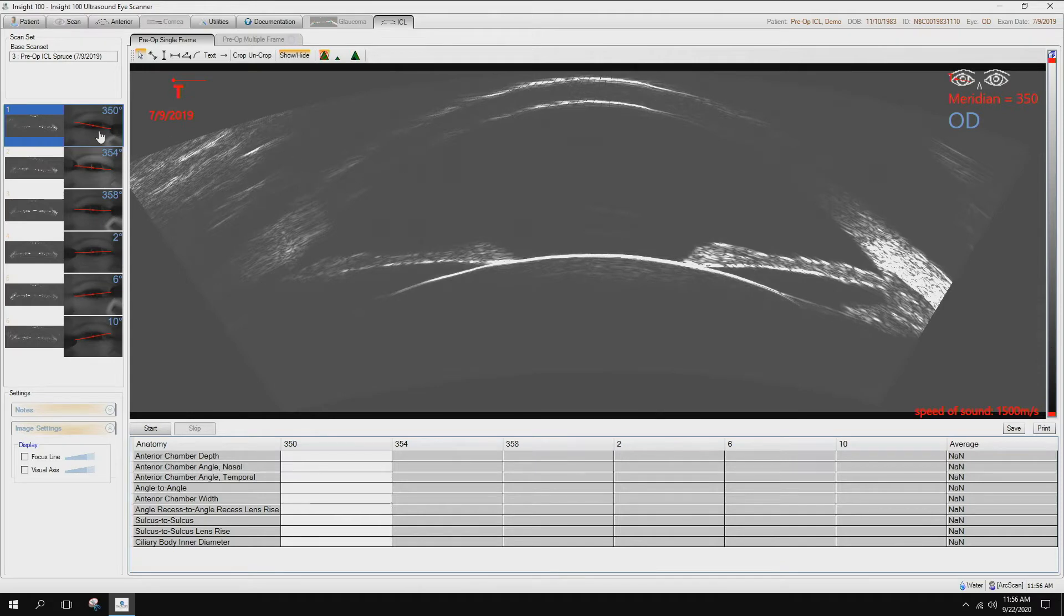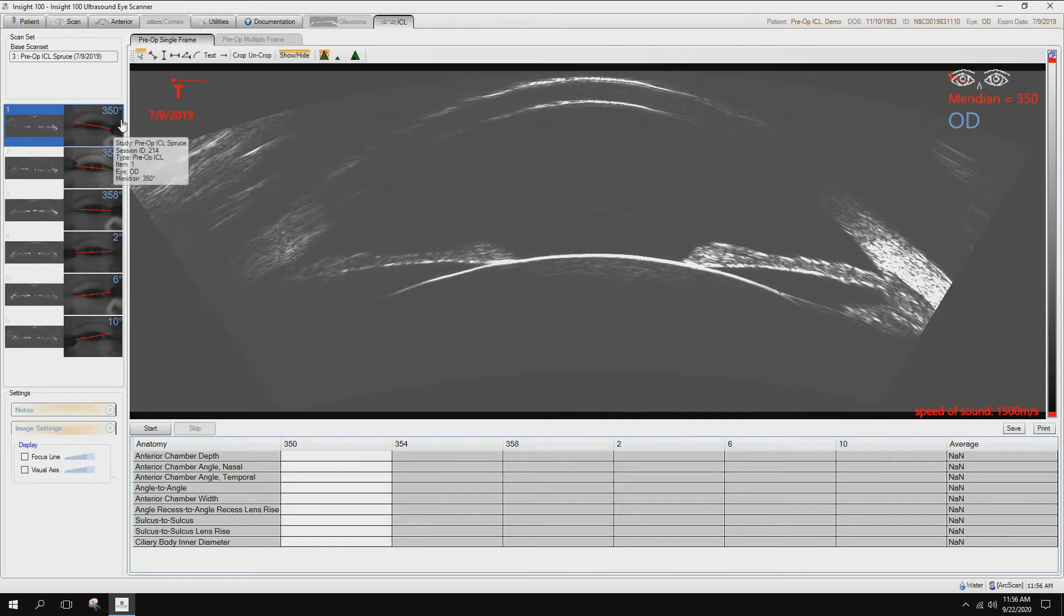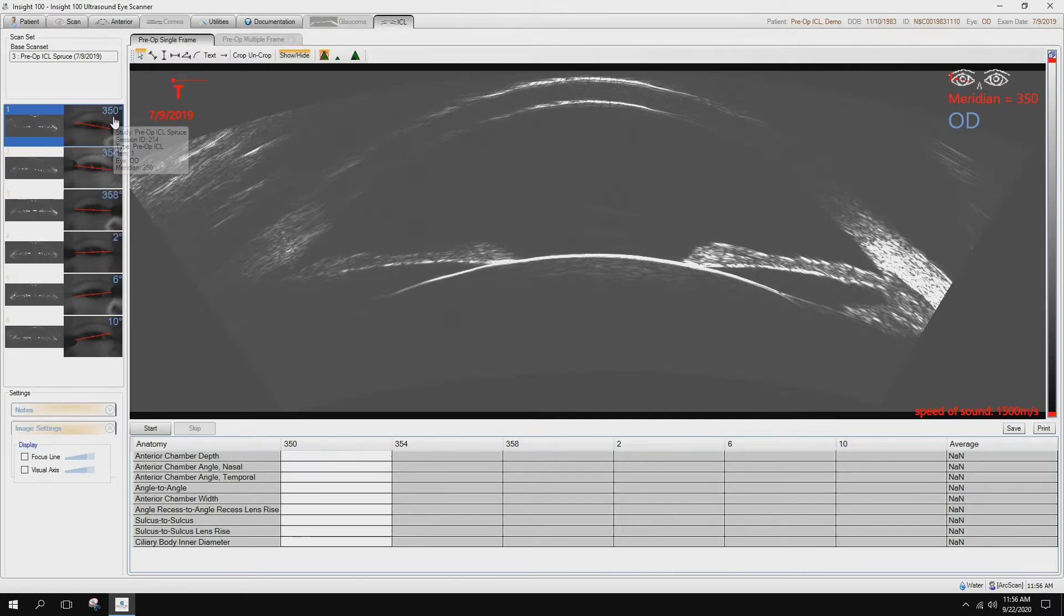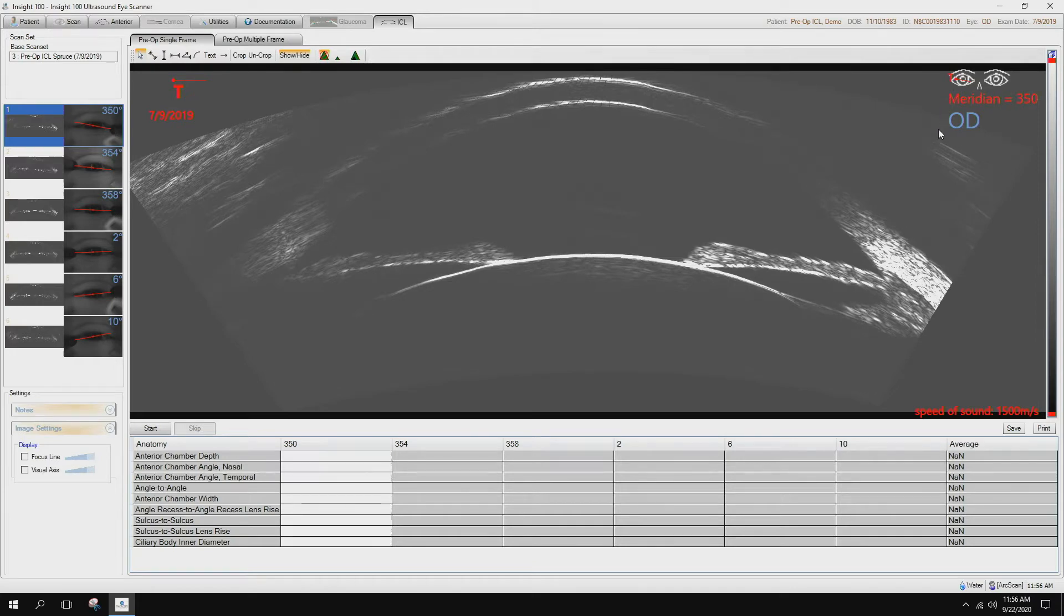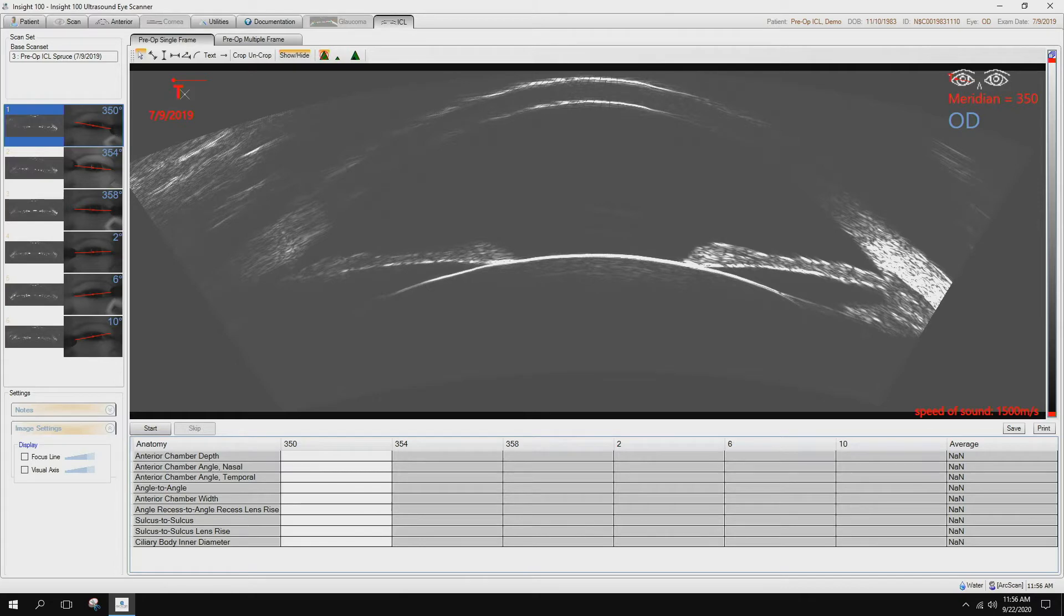On the left hand side of the screen are the various images that were taken during the scanning. The meridians are clearly identified here as they are on the right side of the machine. So here we are at the 350 degree meridian. This is the right eye of the patient. The symbol up here tells us which is the temporal versus nasal side of the eye. In this case, temporal is on the left hand side of the image.